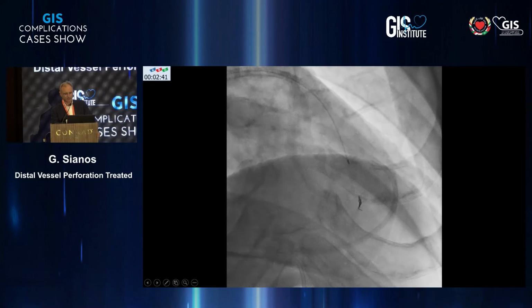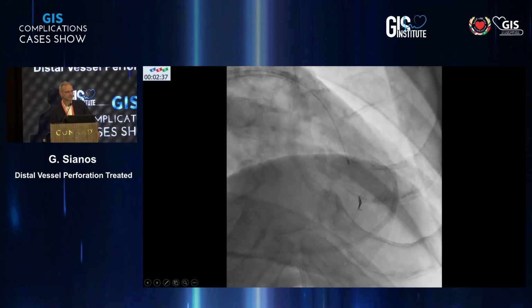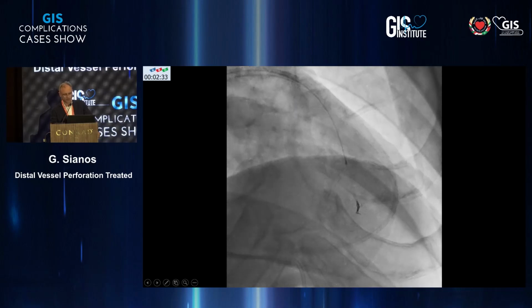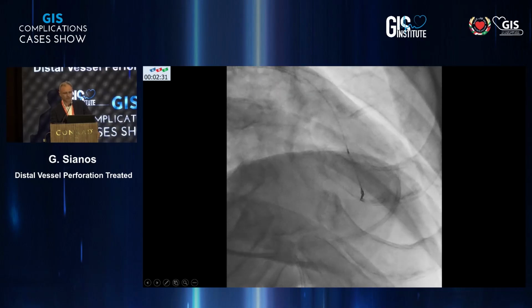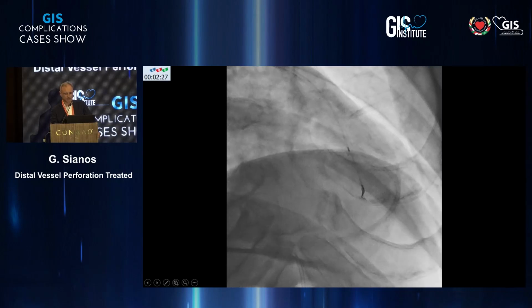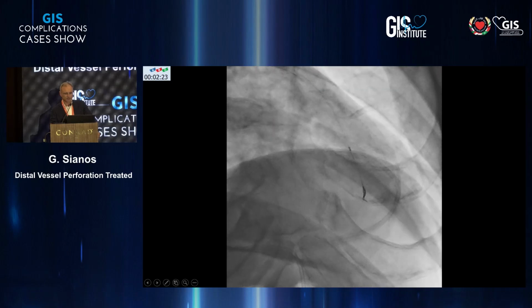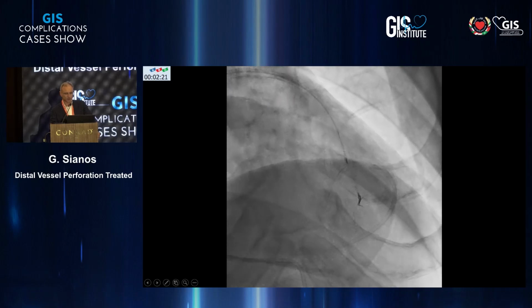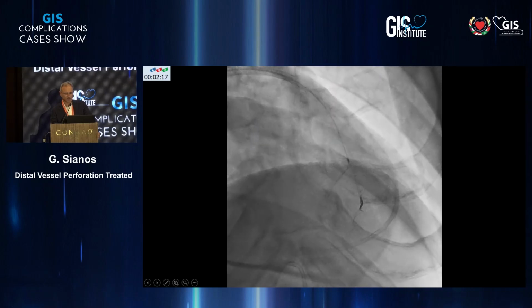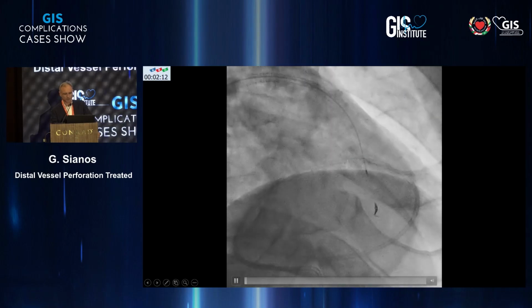So what happened is that unfortunately we didn't follow. This is a coil that is a neurocoil. We developed the neuro service now for strokes. So for me, it was a good experience. The coil is called Optima. It was available, it's a detachable coil. It was 2 millimeter by 3 centimeter. I'll show you from the other side because that's a question here.